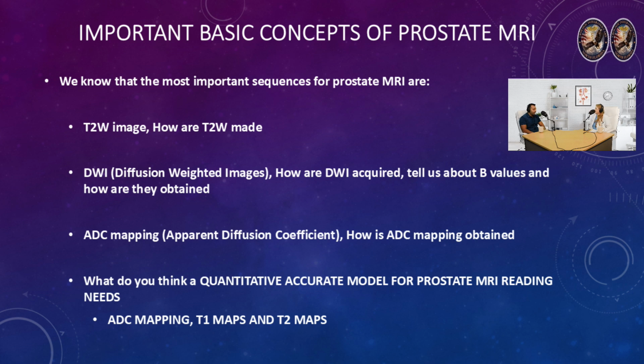I love studying applications of it and optimizing sequences, really analyzing it for the purposes of bringing it to medicine and making it better for physicians to actually be able to use this kind of stuff. So I'll start off with T2-weighted images.